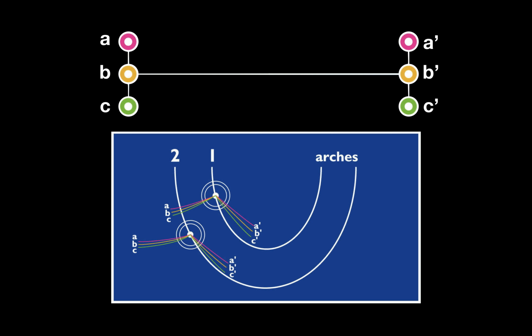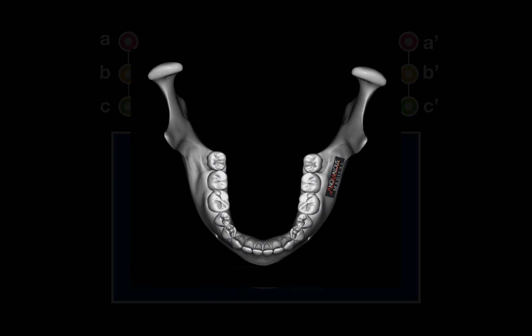We know just by simple geometric, compass drawings that the position of the tooth and its distance from the rotational center will affect the ridge groove direction. And so the further away we get from the rotational centers, and that's what the Kois bow did as well as the conventional facebow, the more obtuse the angle between working and non-working grooves become. This is creating negative error. There's less likely to be interference when we return to the patient's mouth.